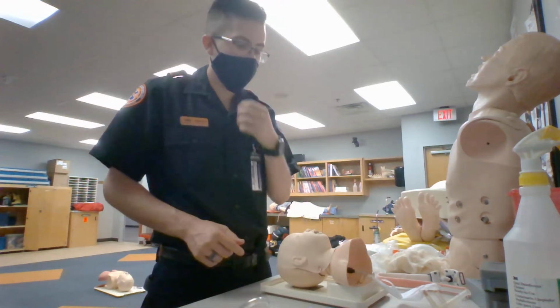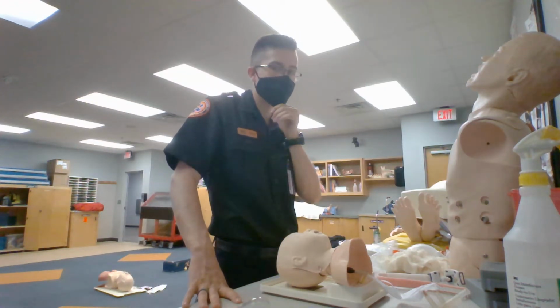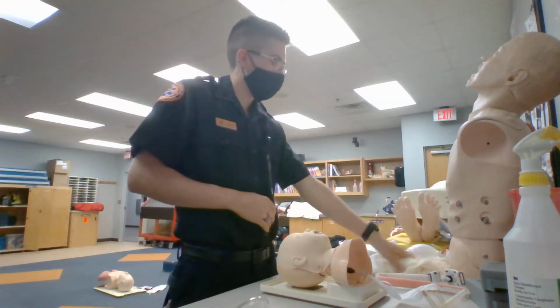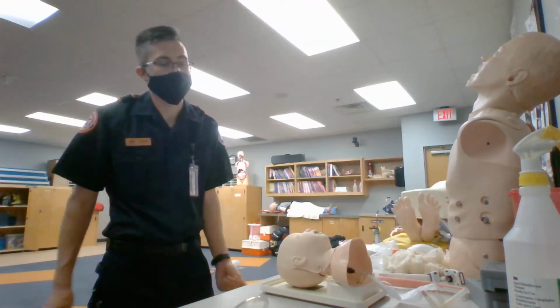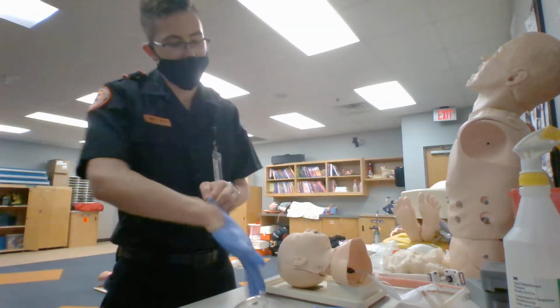First thing that I want to do is gather up all my materials, such as a suction device, the laryngoscope with a couple different size blades set off to the side, an ET tube with a range of about a 3.5 to 4.5 set aside. I want some form of padding, an OPA, a stabilization device, a BVM, and capnography. After I've gathered up all my materials, I'm going to put on proper PPE.